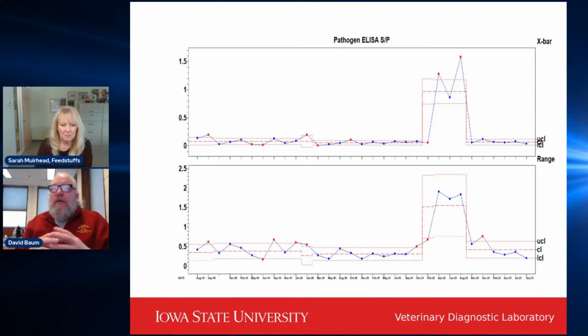So in conclusion, I think this tool is very important for pork producers to be able to understand what the health status based on antibody production is of any population of animals. And it should also foster some tremendous conversations between the sites and their suppliers so that they can understand what the population dynamics of the pathogen antibody results are in both populations.